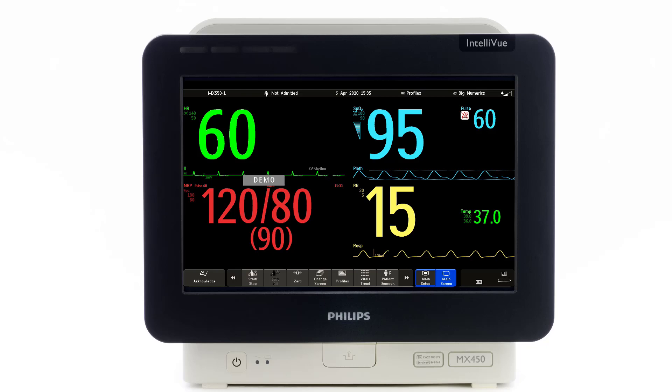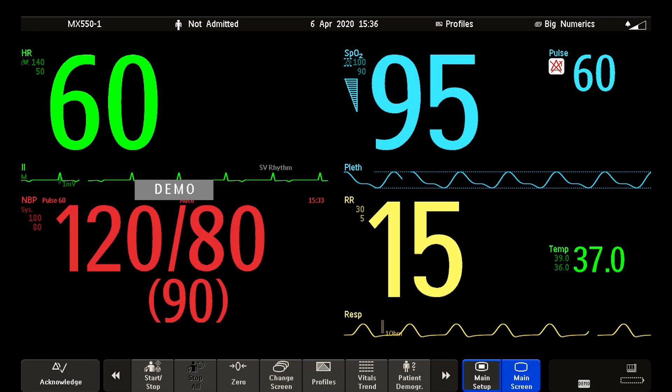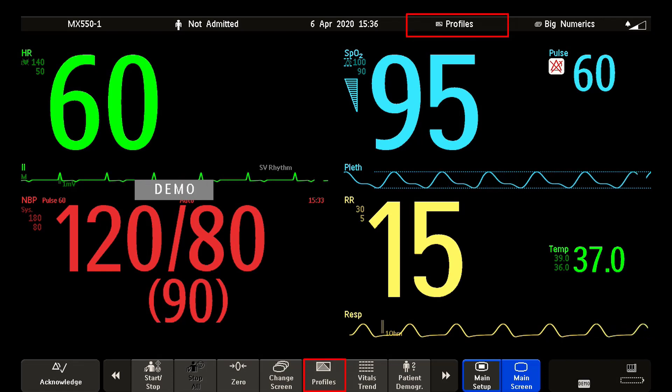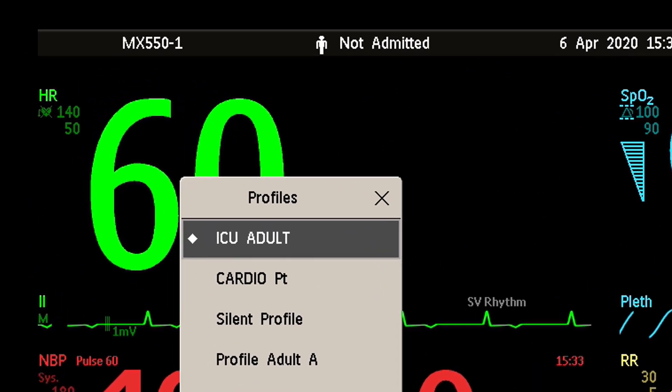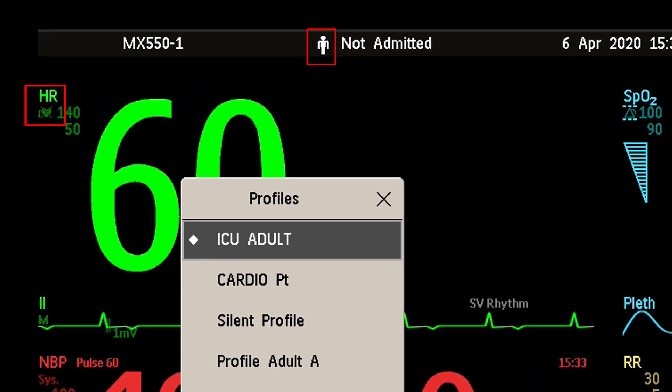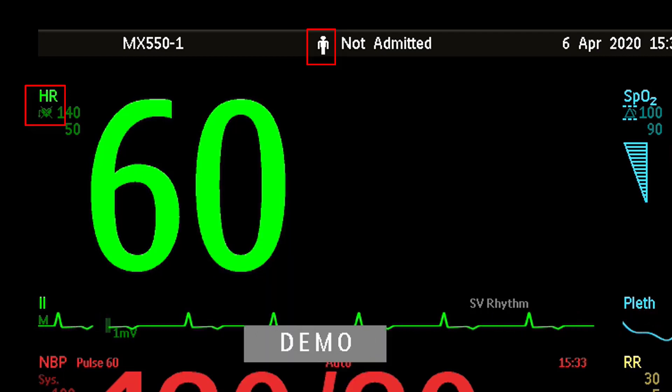Make sure you have selected the correct patient profile in your monitor. Profiles are predefined monitor configurations that let you change the configuration of the whole monitor so you can adapt it to different monitoring situations. To view the profiles in your monitor, select Profiles in the Monitor Info line or select the Profiles Smart Key. In a chosen profile, verify the patient category and the paced mode, and adjust if necessary. These settings are important because they determine how some measurements are performed.